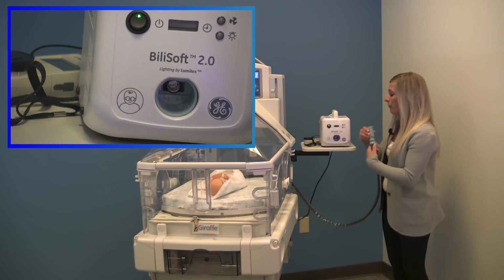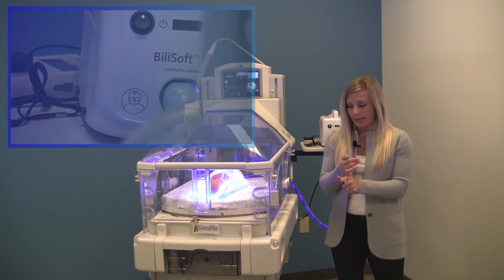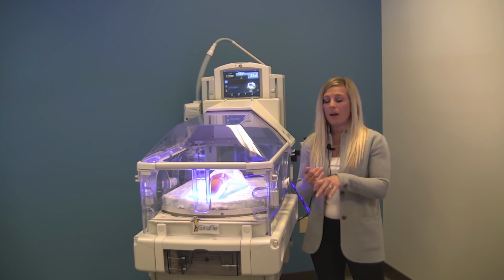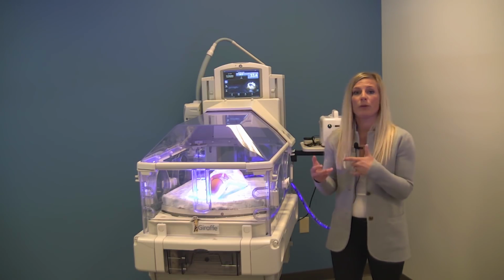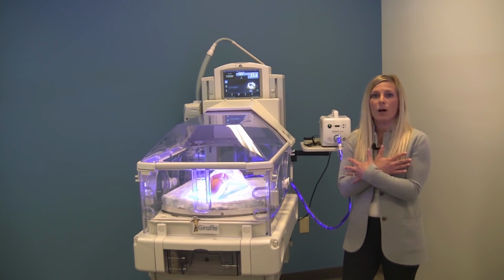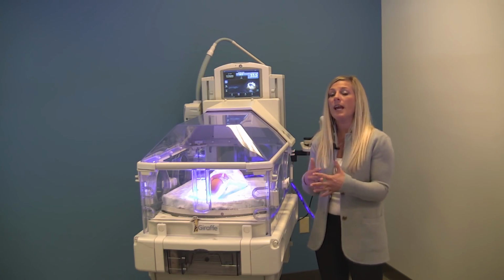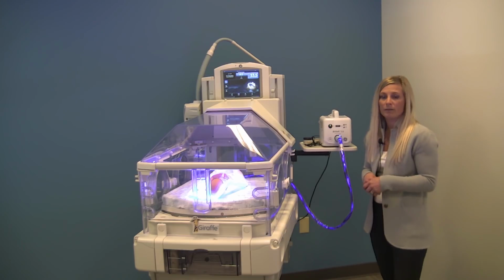Now, an important consideration, though, is the fact that when we add in our phototherapy blanket, especially for those big kids that can get a little sweatier, you're adding in a blanket, you're adding in positioning devices, right? So we're putting on the pad cover, we're putting in the nest, maybe we're swaddling them. And so we're just adding elements that can contribute to the heat pattern and to the environmental temp for that infant, right? So things that they're up against and that whole heat gain, loss, and transmission pattern. So something to really consider is the positioning aids that you're utilizing and how that's contributing to the temperature, not the actual pad itself in the phototherapy.